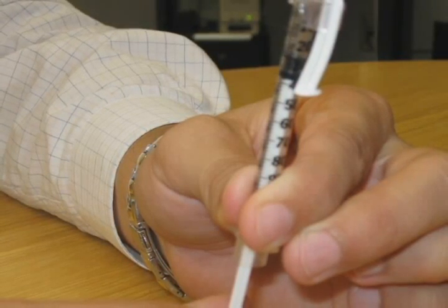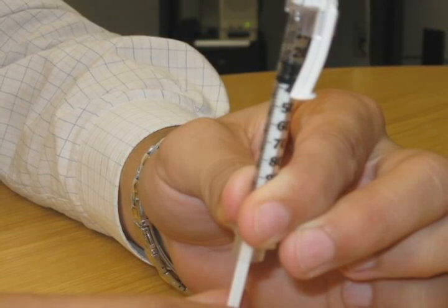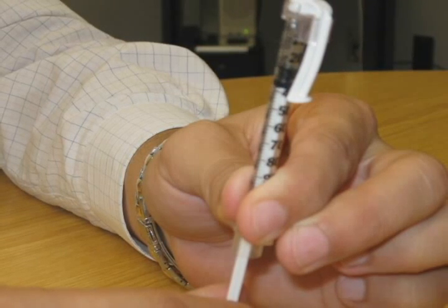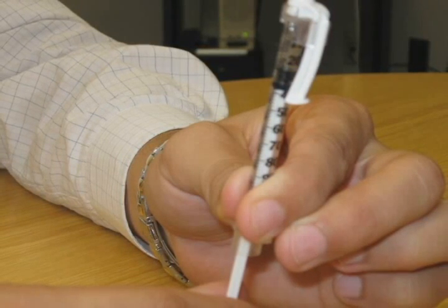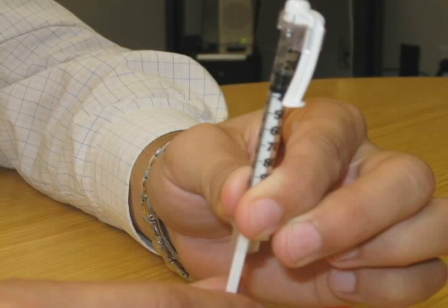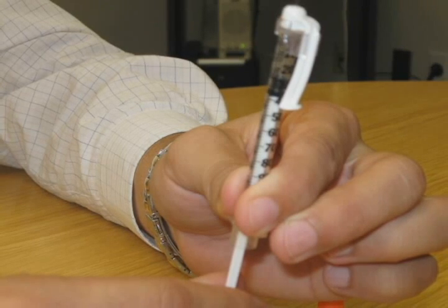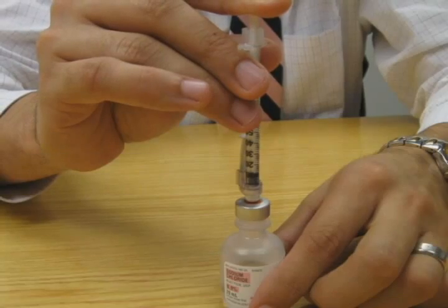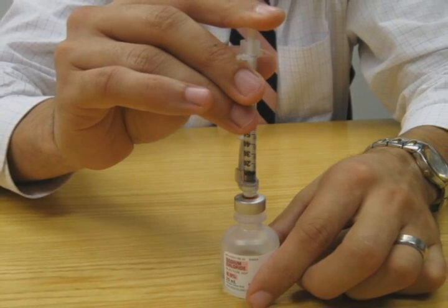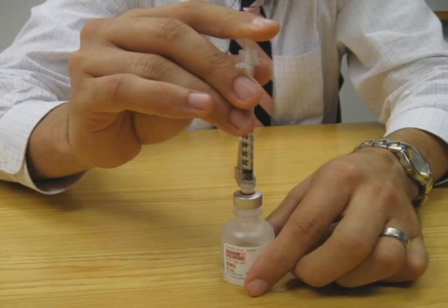Pull the plunger on the syringe back to the number corresponding to the desired units of insulin to be given. For instance, if you are to inject 10 units of insulin, you would draw the plunger back so the end of the plunger is at the line corresponding to 10 units. Make sure that you are using a syringe specifically meant for insulin injection. Then gently push the tip of the needle through the rubber stopper and push the air in the syringe into the vial of insulin by pushing down on the plunger.